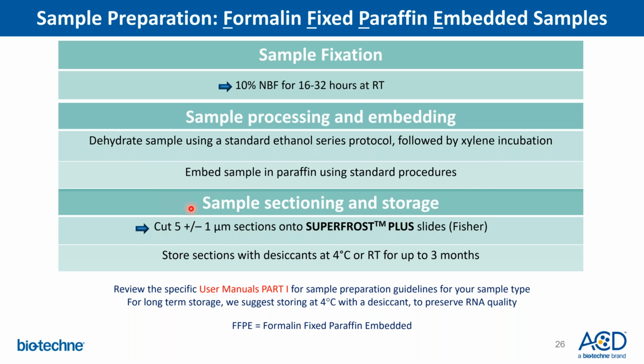And then for sectioning, we recommend you cut the sections at 5 plus or minus 1 microns and mount them onto Superfrost Plus slides. With regards to the storage, you can store these sections with desiccants at 4C or room temperature up to 3 months.